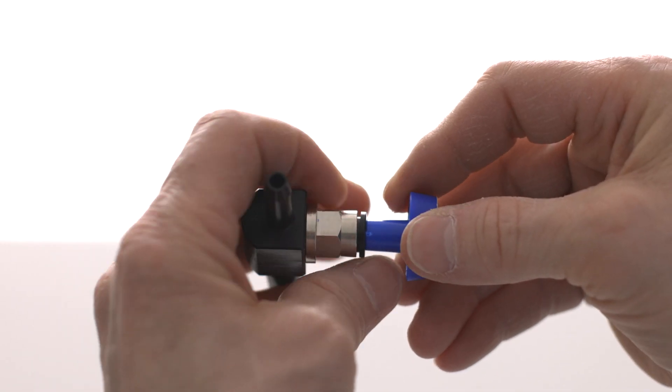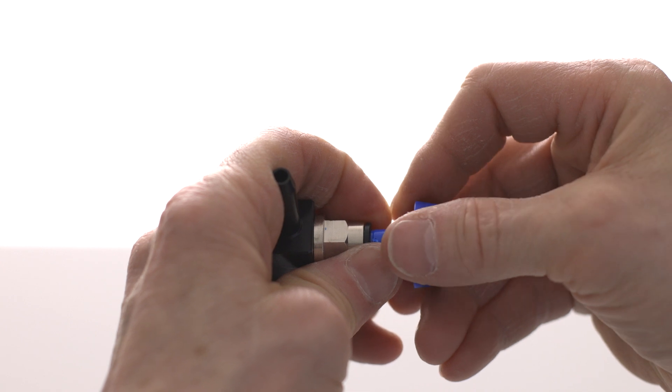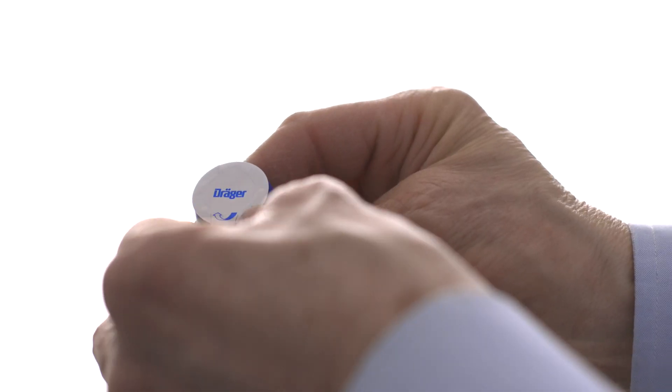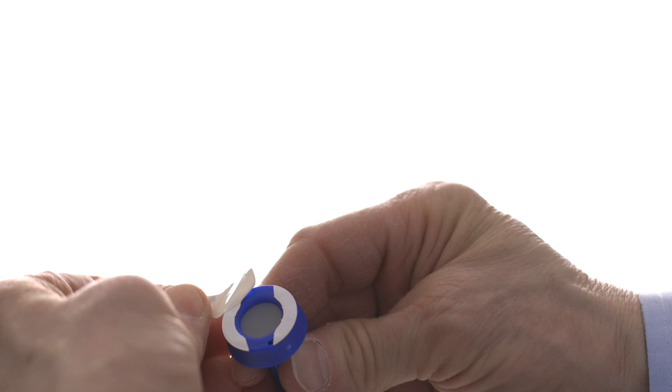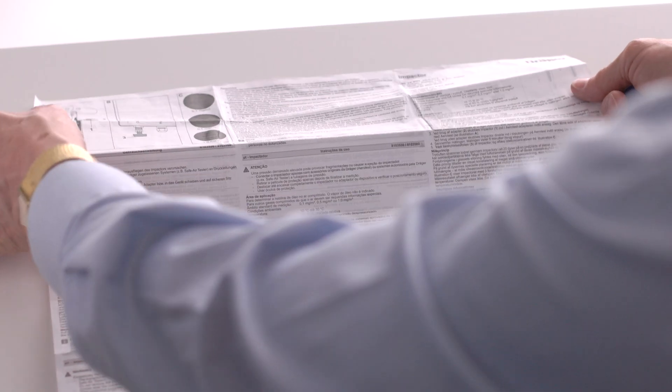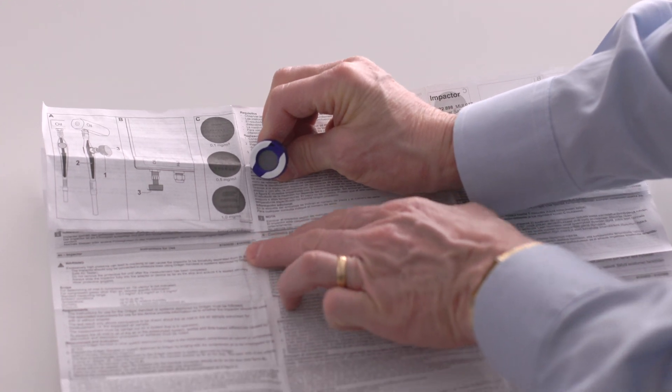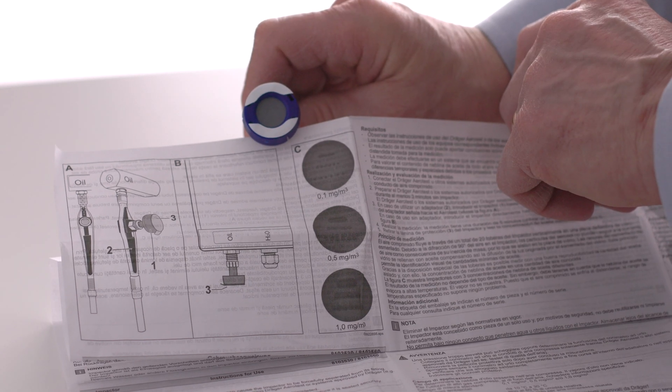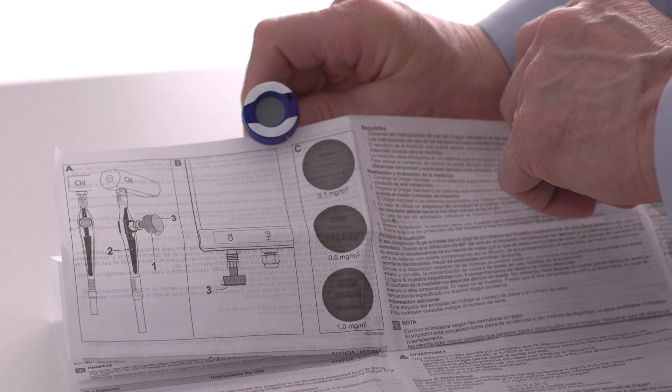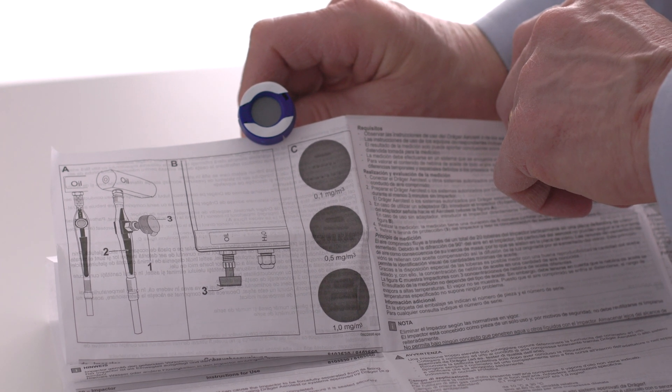Press down on the black ring of the adapter to release the impactor. Remove the tear-off cover with the Draeger logo to expose the indication surface. Compare the pattern on the impactor with the three reference standards in the instructions for use. Here we can see no visible pattern indicating the oil is below the detection limit of the oil impactor.